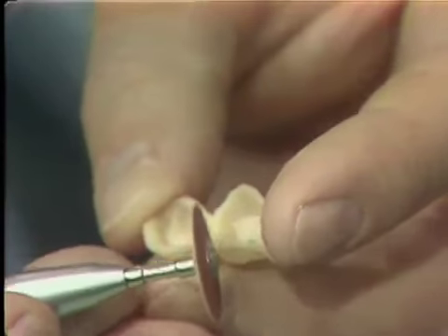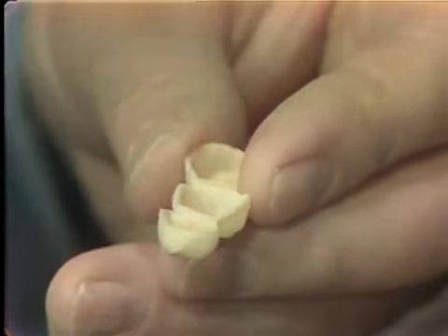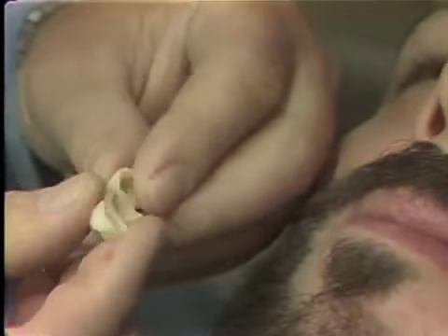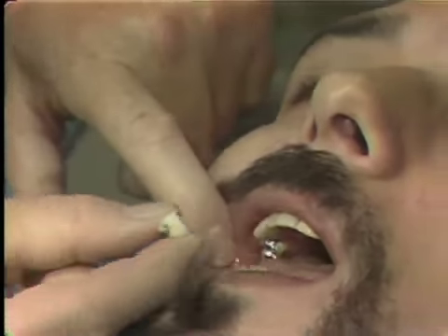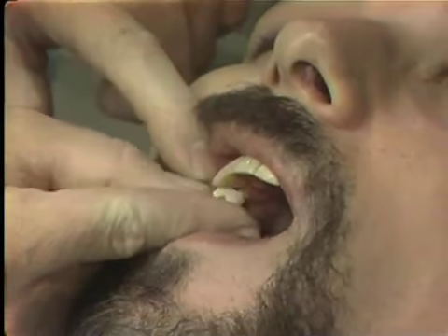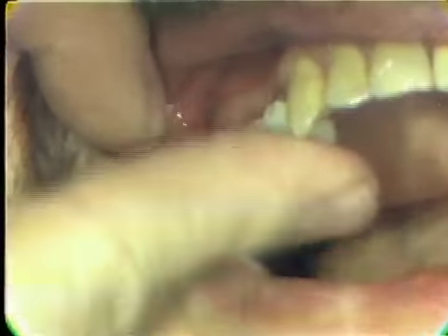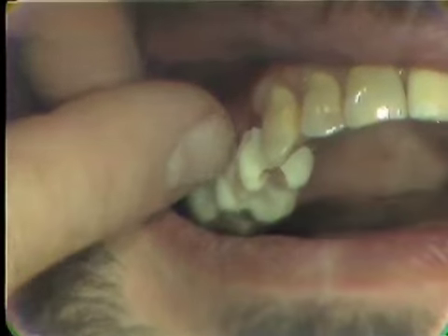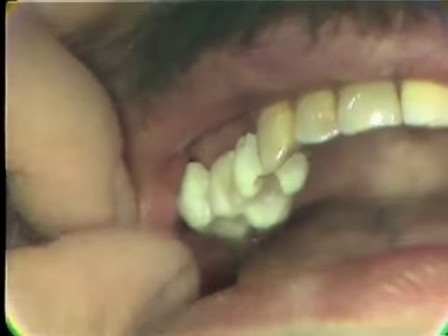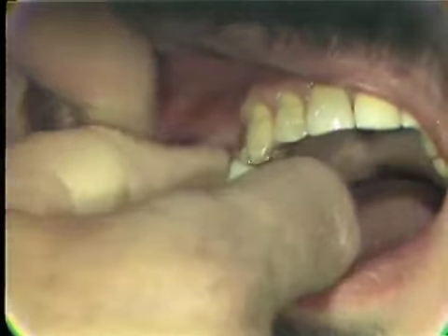Once we have the temporary trimmed, we can go back now and correct any of those areas in the mouth where there's a discrepancy in the margin. In the bicuspid area, the part that we had painted around the gingival portion of the tooth in the mouth, as we can see here, did not adhere to the shell part. So now we will go ahead and correct this area in the mouth.